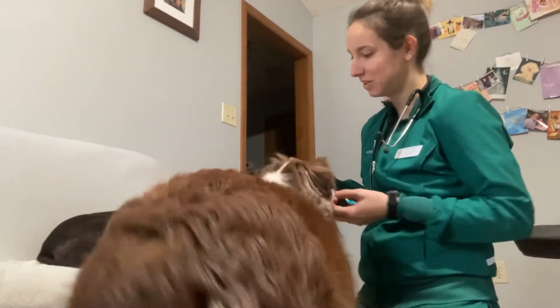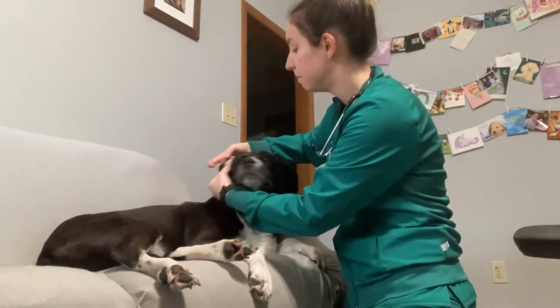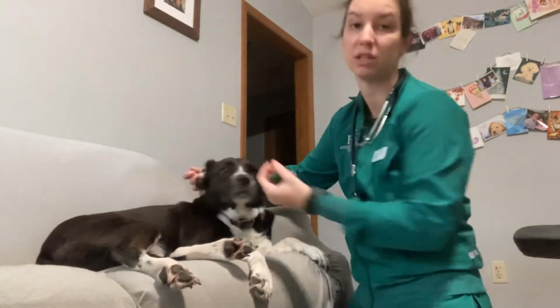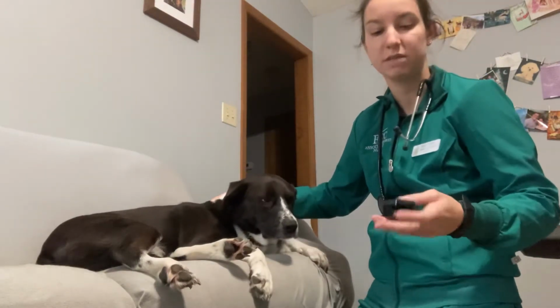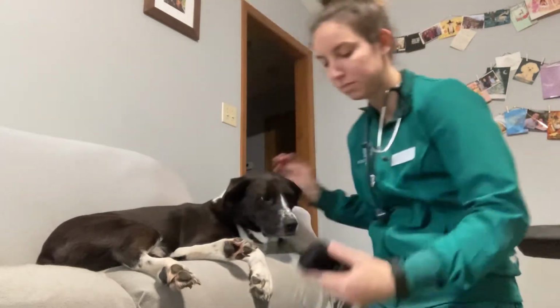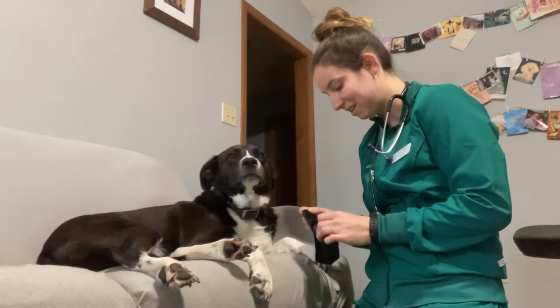Sadie, we have some alternatives. I know sometimes my vet will take a look inside their ear where the fur isn't anymore. You can essentially do the same thing as a cap refill. In Sadie's case, color returns in less than 2 seconds. With children, I know that is a very common thing to use as well. So that is our pulse ox. Sadie, you did so well.